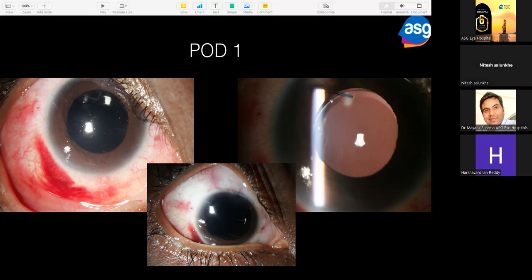There, the advantage is that you need only a small conjunctival peritomy. You only need a nasal and temporal peritomy of about 2 to 3 clock hours for your scleral pocket and your sclerotomy, as compared to a 180-degree peritomy in a rigid lens. And your incision is just like a phaco wound.